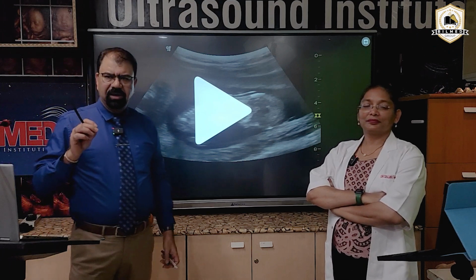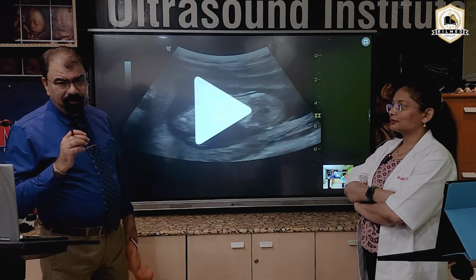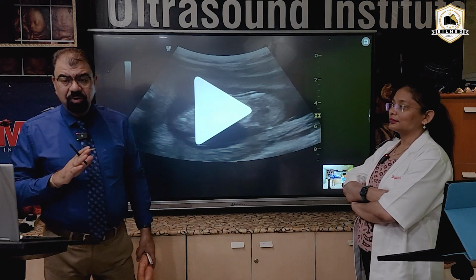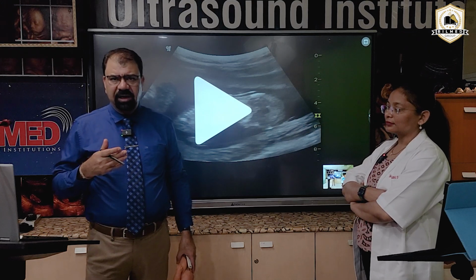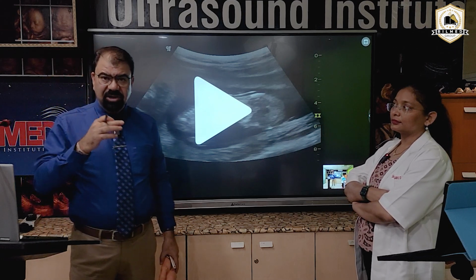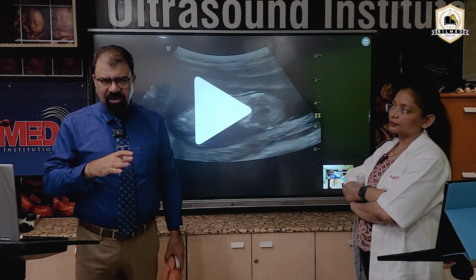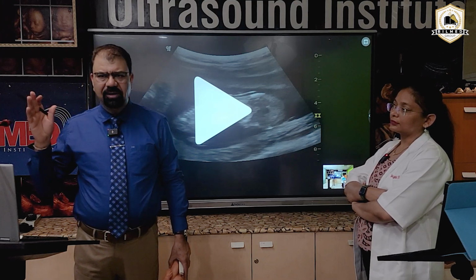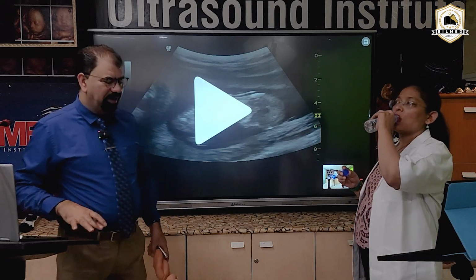So, the topic, level 1. In level 1, the basic important point you have to understand is the section. What section has to be taken from the fetal side to take a level 1 scan. If you are not understanding the section, you will always struggle with this NT. If you understand this section, then level 1 is a kid's job. Otherwise, you will struggle for decades to get the nasal bone, ductus venosus, and all the things needed in level 1.